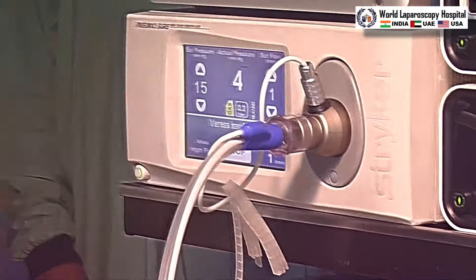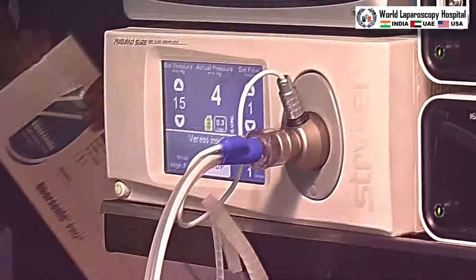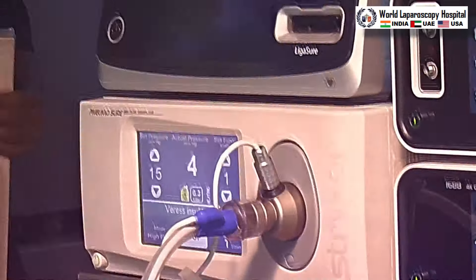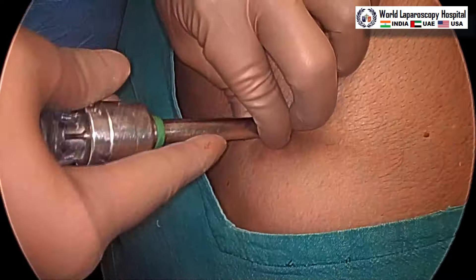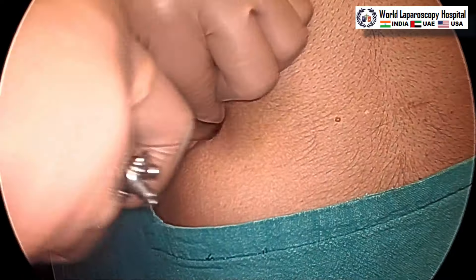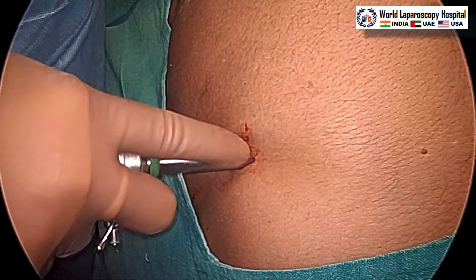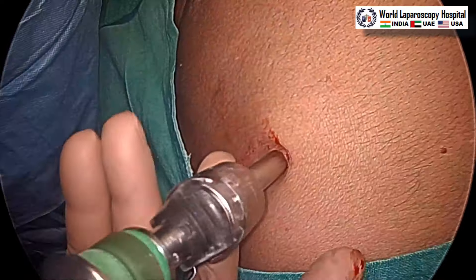Now we can see pneumoperitoneum is started. Preset pressure is 15 and actual pressure is gradually increasing. Within the first few seconds it should be single digit and slowly the actual pressure will increase. Now pneumoperitoneum is established and we are increasing the incision and putting the first port again at Misra's point. The advantage of Misra's point is that after creating pneumoperitoneum it will remain stretched down — and this is the hissing sound you will get when removing the thumb from the head of the trocar.